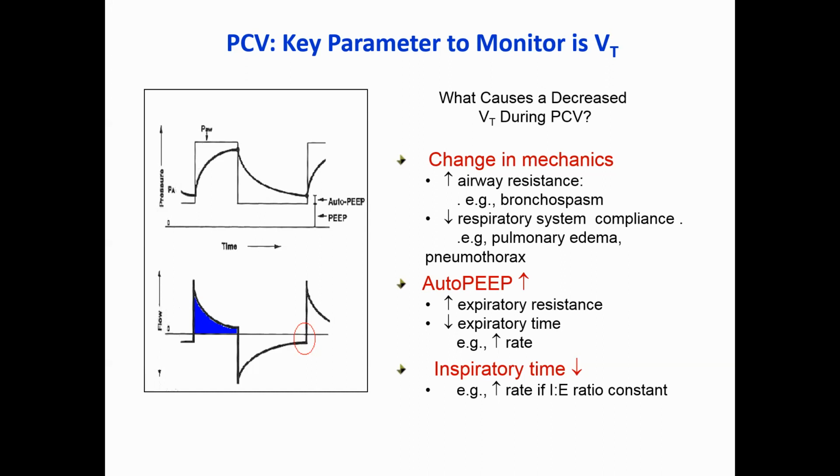Like if you have ARDS, COPD, asthma, or resistant pneumonia, that's how to set it up. If you're asking what would be the first mode to use, our respiratory therapists here have a culture of volume control ventilation. So the first thing they go to is that. And according to what you achieve with it, particularly in ARDS, you're going to end up with very high peak pressures and you cannot really deal with them. And after you sedate the patient and paralyze, if you still have high pressures, the majority of us will switch to pressure control ventilation and then we start going that way.